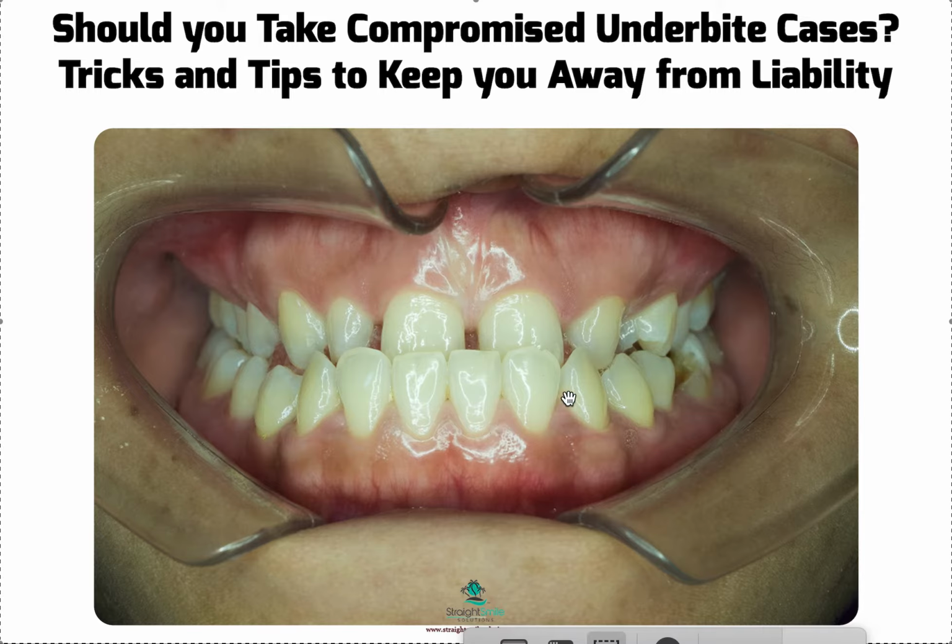Obviously, this one is missing a lateral, it's got a peg lateral here. It's probably a CR-CO shift. It's probably not as hard as you think, because if you consolidated the space, made space for an implant here, retracted this, and got it into CR, it actually may not be as hard as you think. Maybe you can't fix the posterior crossbite, but I'm pretty sure you could fix the anterior fully as long as you're willing to get an implant here.